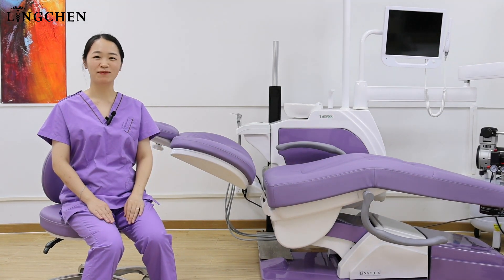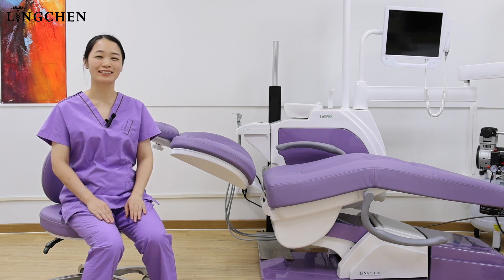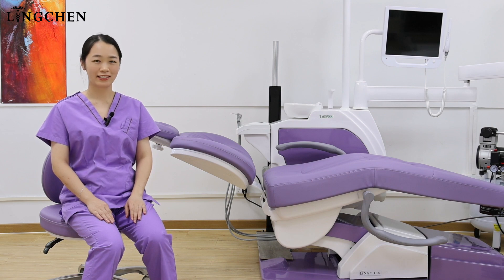Hello, this is Anna from Lingchen Dental. Dentist feedback that the dentist stool is easily broken because of the incorrect using. Today we will share with all how to use it well.